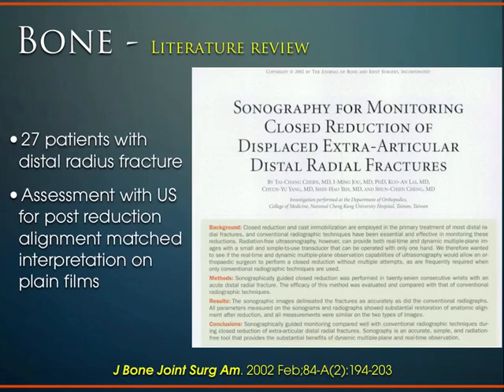And that's true for bone as well. And then as you try to put it into a clinical perspective, so okay, great, I can image it and I can see the fracture, but can I use that to then treat the patient? And when we talk about, especially in an emergency room setting, we're doing reduction of fractures and closed reduction of fractures, and there's this one particular study showing that it can be quite successful with that.